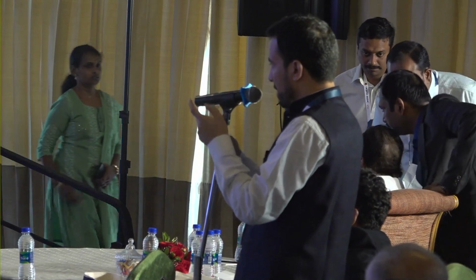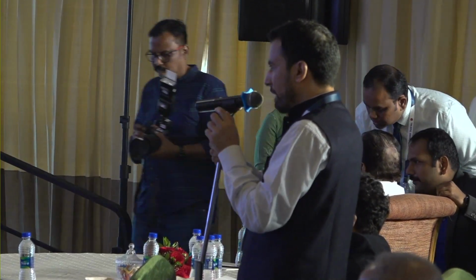Okay. Any questions from the floor? Sir, I have a very basic question. This is regarding mapping of pathways and trying to map their pathway potential. As sir told, we first try to create an antegrade block in the pathway and see that the potential is not part of A, and then we pace the V and show that this is not part of the V, that way we are sure. So my question is where exactly to pace in the V? Suppose we are mapping the pathway in the antegrade way by pacing A. Once we change this sequence to V pacing, will the V EGM also change by pacing now, because now it's going in a different direction? I have this very basic doubt, I want practical steps on it.